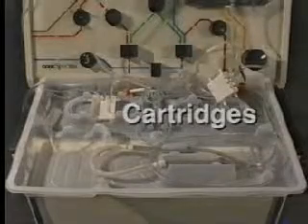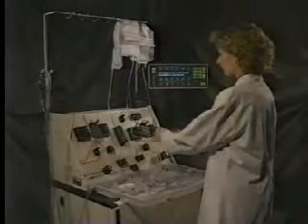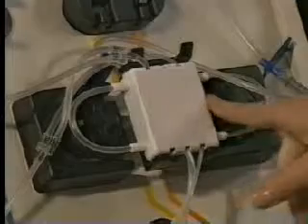Next, we need to load the cartridges. Place the return pump cartridge between the plasma and collect pumps. Snap the cartridge into place. The code label on the cartridge should be facing up.